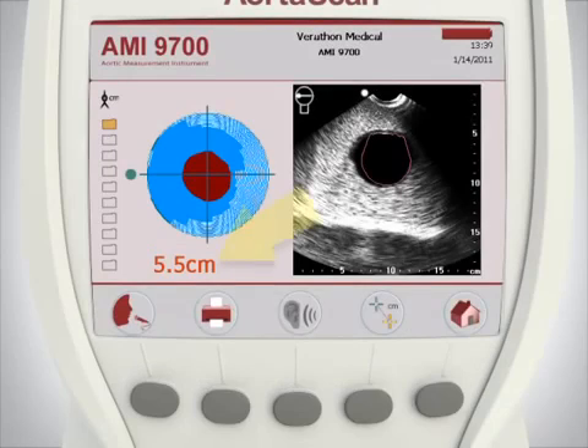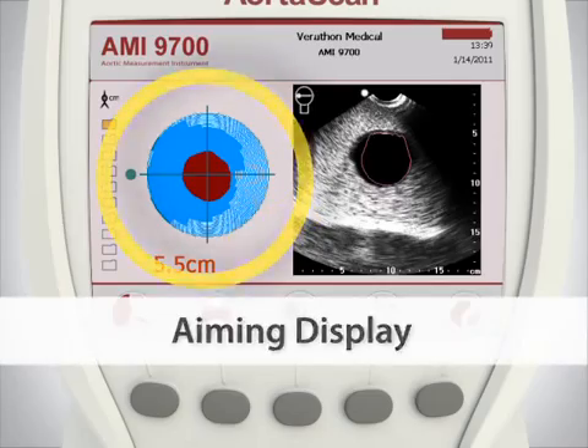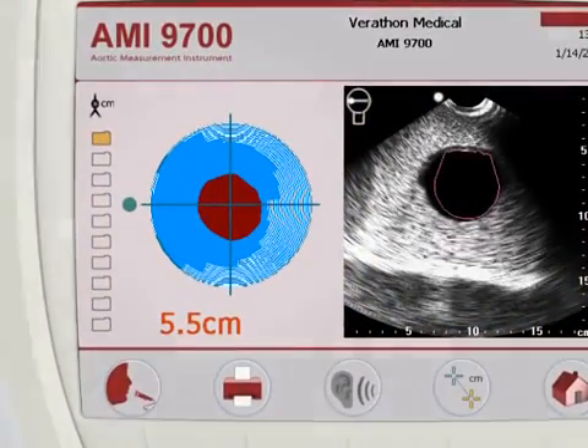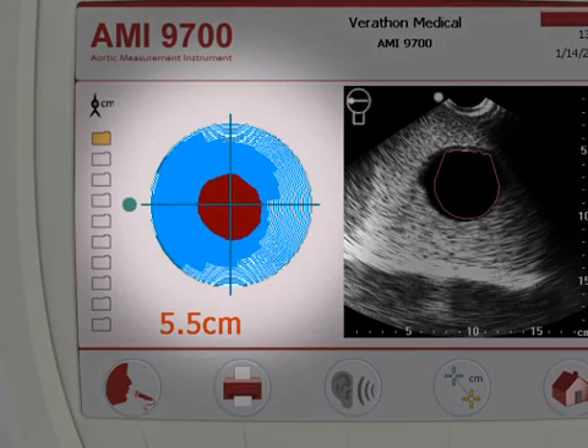The results screen shows the aortic diameter in centimeters, along with the aiming display and the results display. The scan is accurate when the aorta image is centered on the crosshairs of the aiming display. The aiming display shows the location of the aorta relative to the ultrasound probe, as viewed by the probe looking into the body. If the measured diameter is larger than 3 centimeters, the abdominal aorta is shown in red and the measured diameter is displayed.